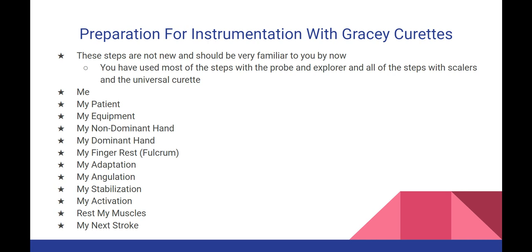Me. Am I at the correct operator position? My patient. Is my patient's head in the correct position? Have they turned toward or away from me? Does the headrest need to be adjusted up or down? My equipment. Is my light and delivery system in reach?